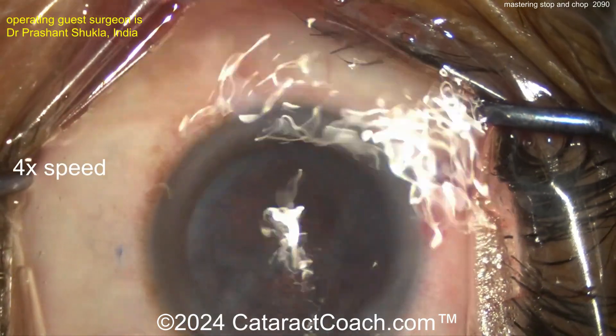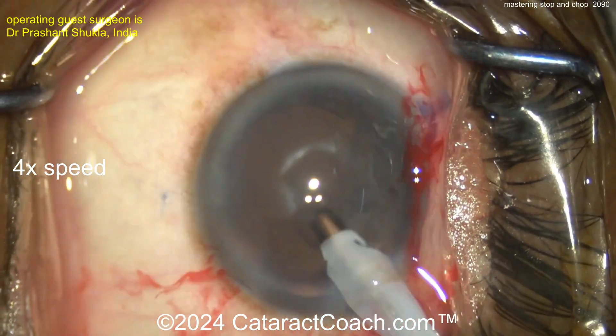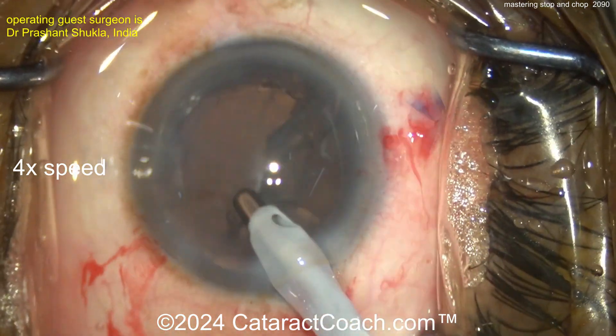The nucleus is out. We can speed up the rest of the case — it looks beautiful. Good cortex removal and a good-looking capsulorhexis.